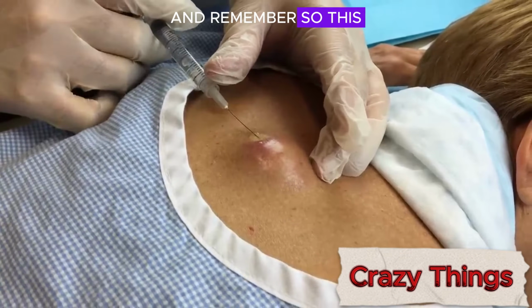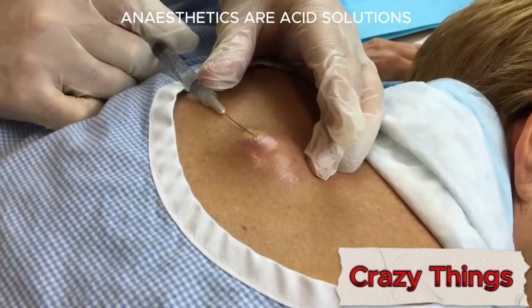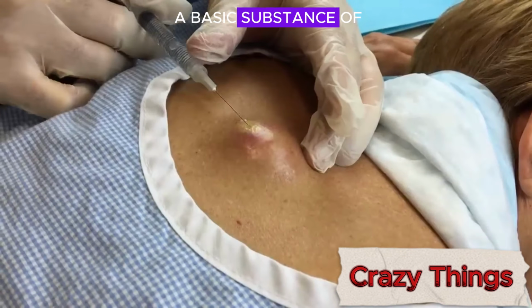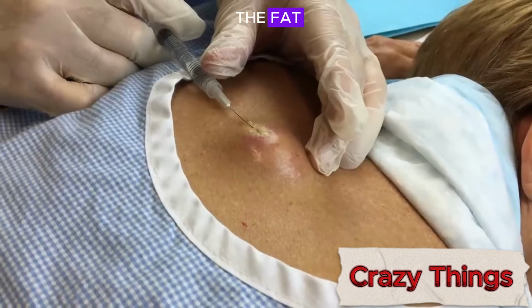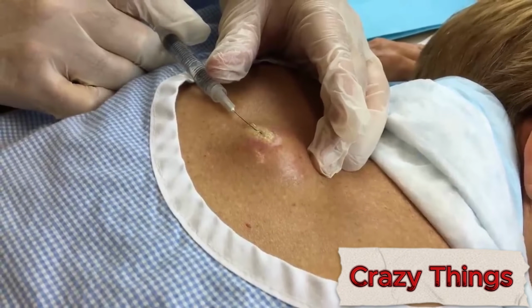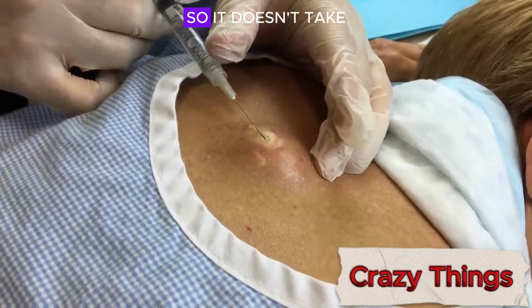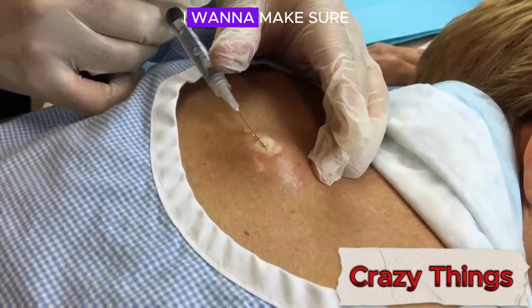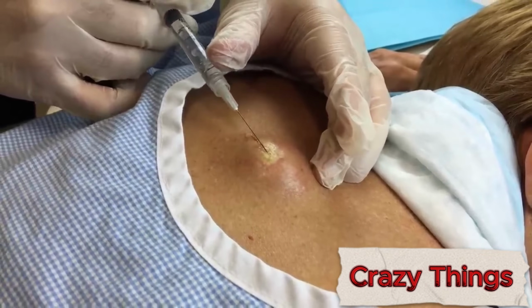And remember, topical and injectable anesthetics are acid solutions that usually meet with a basic substance of the body that makes them neutral and allows them to work, because then they get into the fat-soluble membrane of the cell. The problem when you have an infection is it becomes an acidic environment, so it doesn't take the anesthetic very well. So this is why superficially I want to make sure that this part at least takes, so that she's comfortable with that.